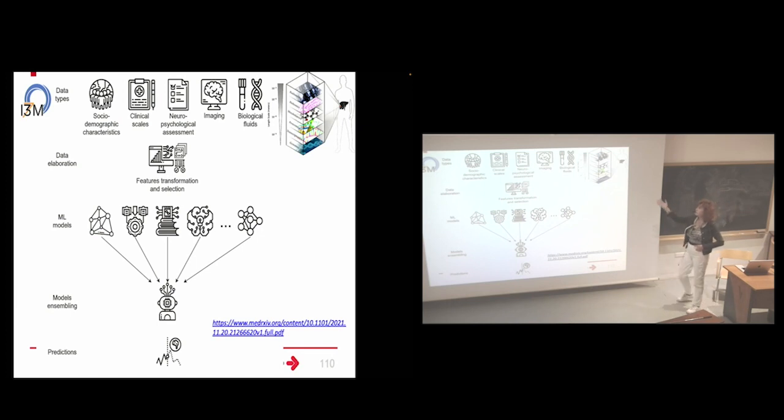And if we look at radiomics, finally here is the perfect gem for radiomics. You have, of course, radiomics coming from imaging, but you have also other information. Then the transformation, the selection of the most important features is made directly by the neural networks. And then you can have the model of your digital twin that can predict the result of a therapy, of a surgery on your digital twin before trying on the real patients.